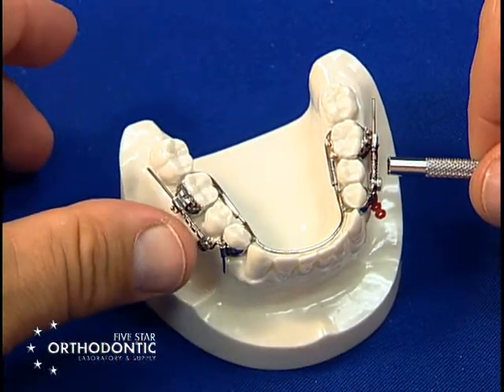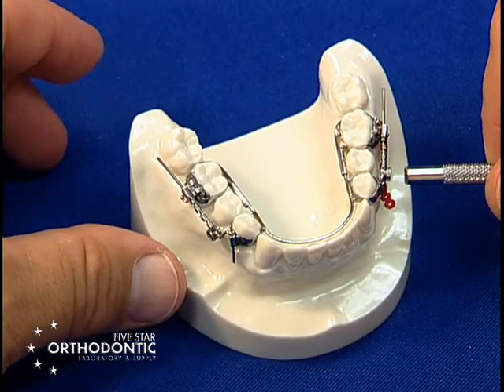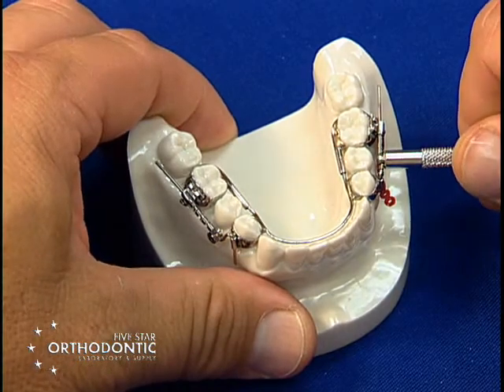Now you can either do this bilaterally or unilaterally. If you have a bilateral molar distalizer, you have to distal drive one side at a time. So one side you will leave deactivated as you distal drive the other side.